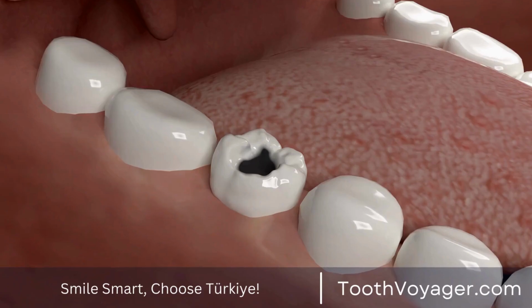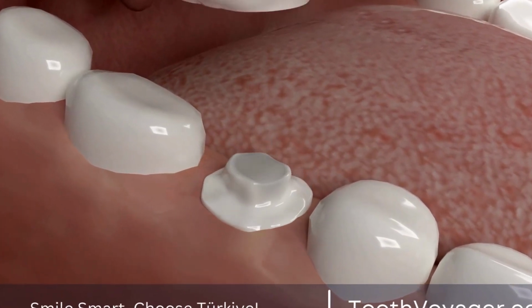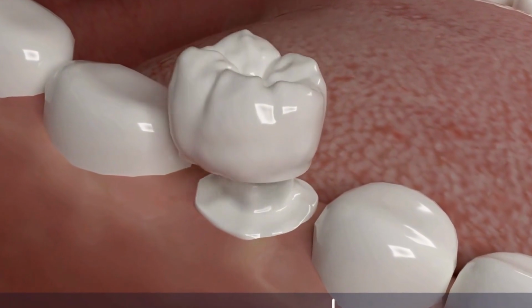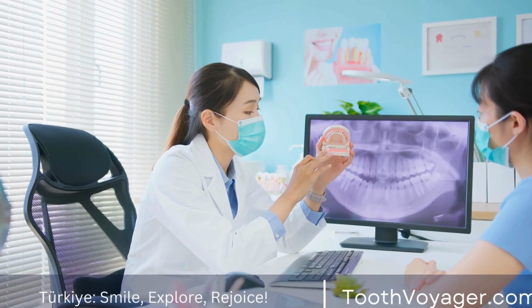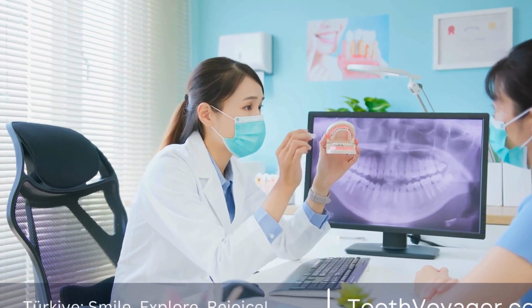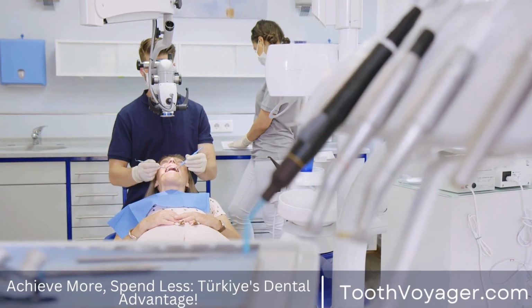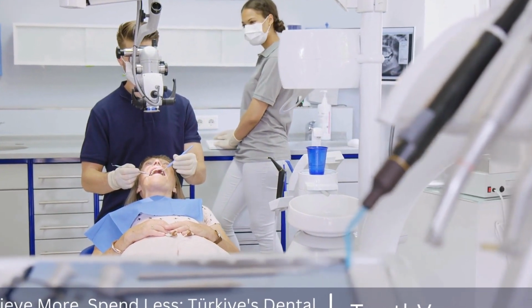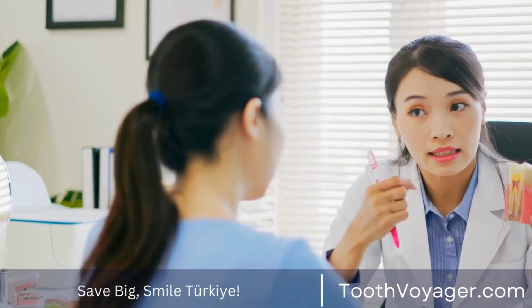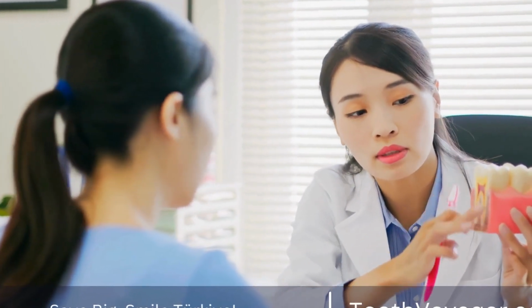2. Ridge augmentation. This procedure involves adding bone tissue to the ridge of the jawbone to create a more stable foundation for dental implants. 3. Sinus lift. This procedure is often necessary for patients who need implants in the upper back jaw, where the bone is naturally thinner. A sinus lift involves adding bone tissue to the sinus cavity to create more space for the implants. 4. Block grafting. In cases of severe bone loss, a block graft may be necessary to rebuild a large area of the jawbone before implant placement.